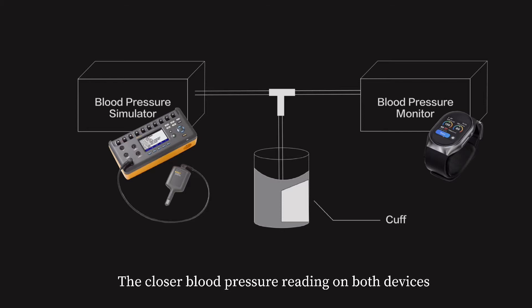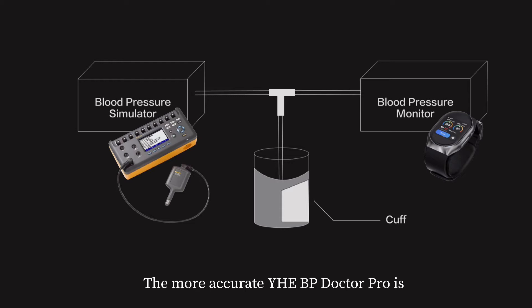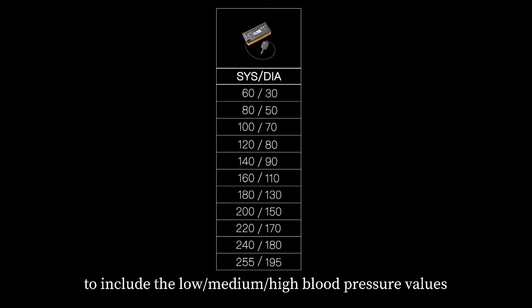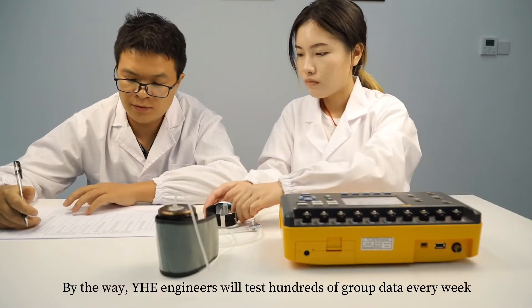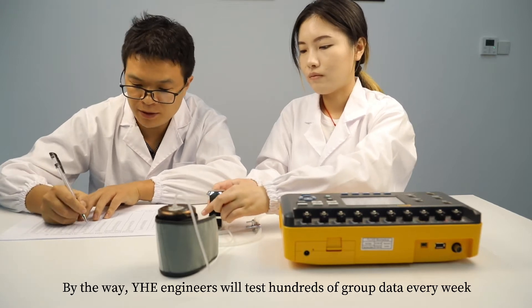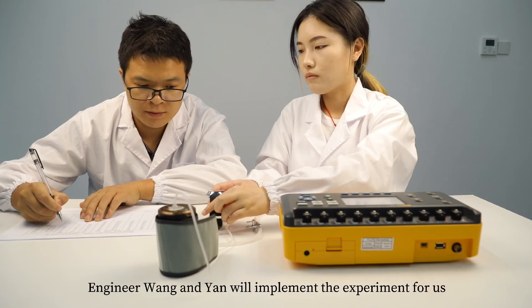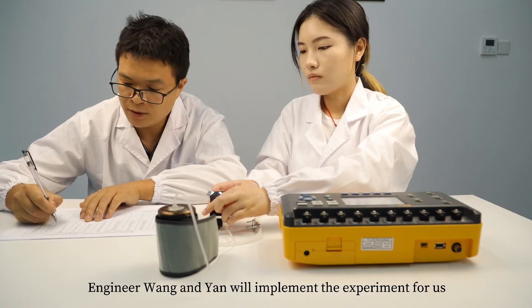The closer the blood pressure readings on both devices, the more accurate YH-BP Doctor Pro is. We have prepared 11 groups of data to include low, medium, and high blood pressure values. By the way, YHE engineers test hundreds of groups of data every week to improve our blood pressure measurement algorithm. Engineer Wang and Yan will implement the experiment for us.